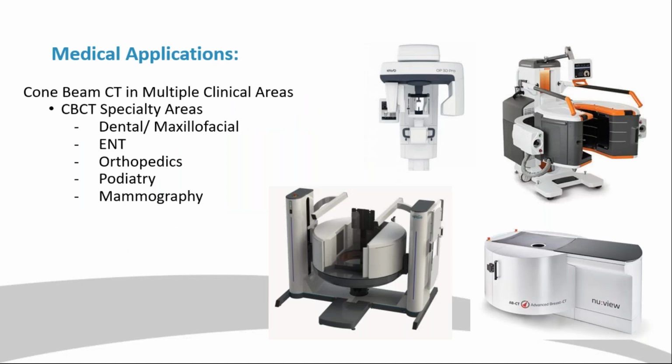We touched on this early, and I know Gary spoke to this list, but when we speak to specific medical applications and how cone beam is being implemented, these are all the specialty areas that RadSite has taken on. I really give them credit for their due diligence to specifically understand how these technologies are being used and implemented in all of these different specialty areas: dental, maxillofacial, ENT, orthopedics, podiatry, mammography.